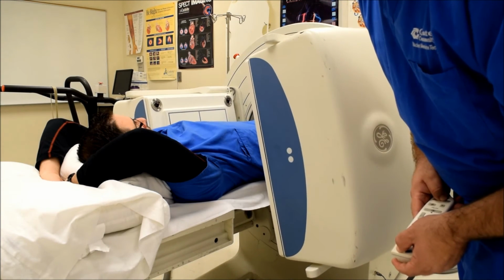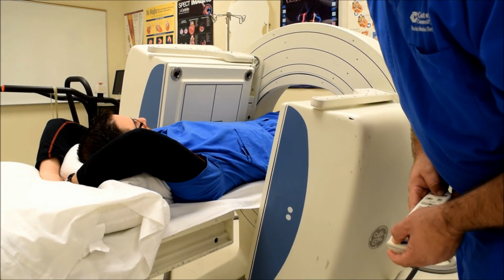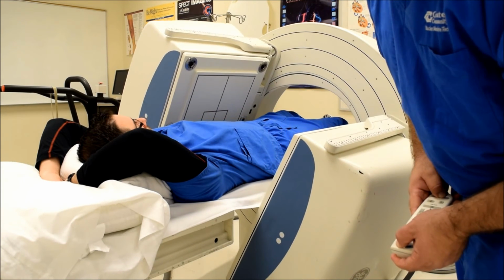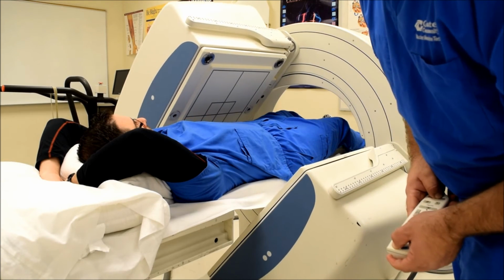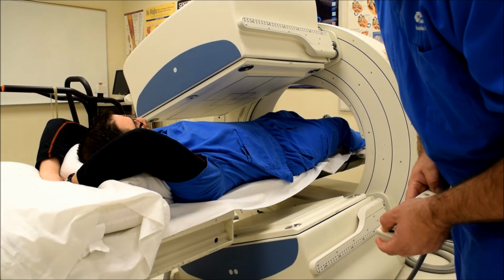Other cameras have what's called auto body contouring, which eliminates the need to make sure you clear all the way around. The camera itself will have sensors that sense where the body's position is, and it'll move the cameras in and out to get to the closest possible position, but also not bump into the patient or the table.